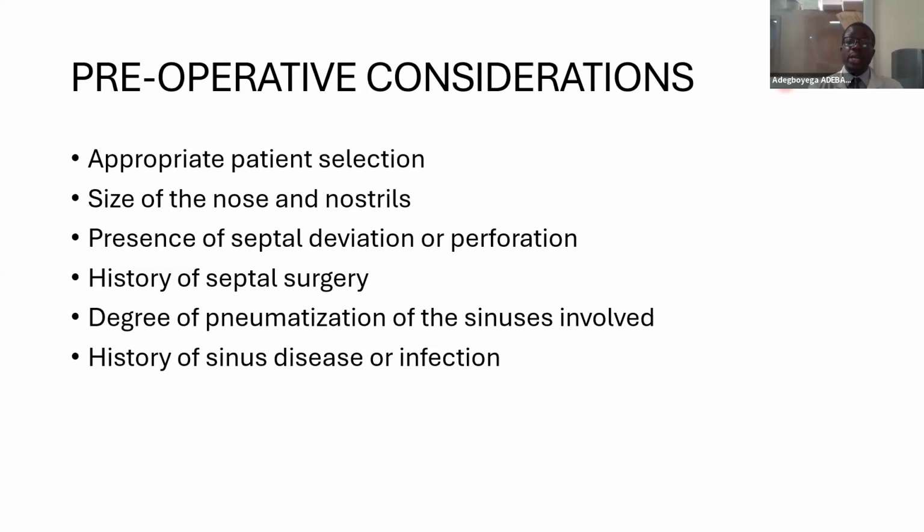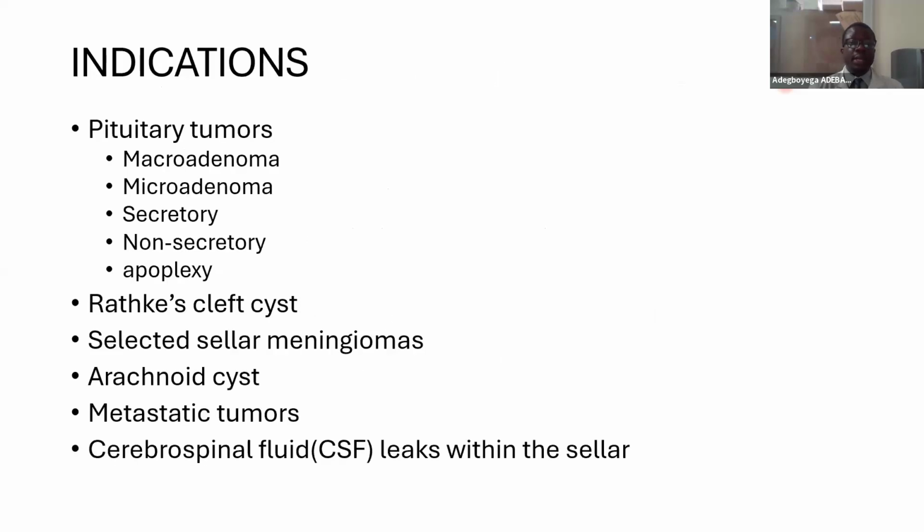This can be noted through studying of the preoperative neuroimaging, especially the CT scan and the MRI. If there is a history of sinus disease in the past or even presently, that's a contraindication to such a procedure.